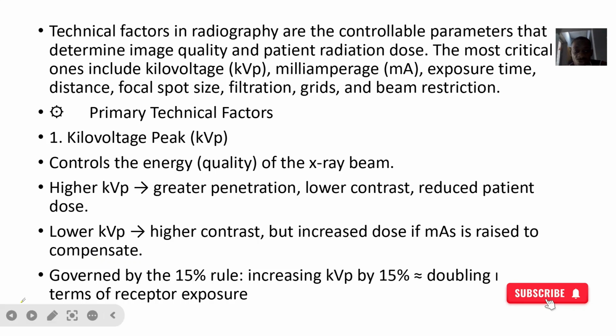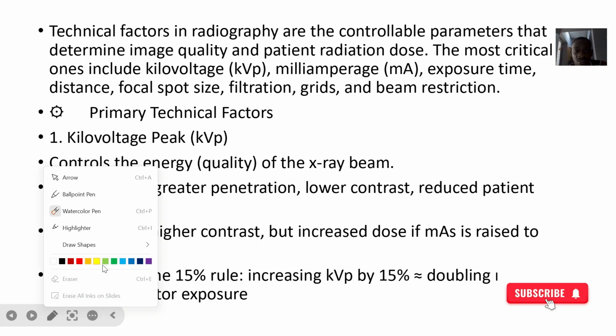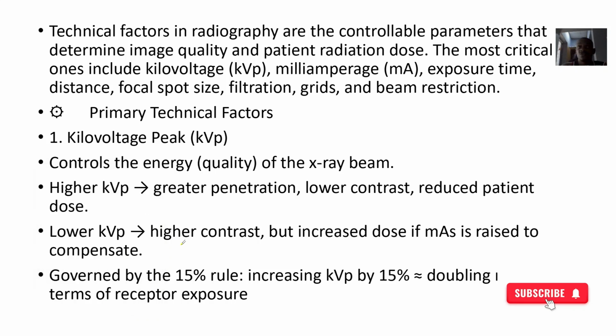So they are basically controllable parameters, and funny enough, they determine how clear your image will be. Do you understand? And they also determine how much of the X-rays actually gets into the patient. Not only X-rays, okay, radiation energy in general.